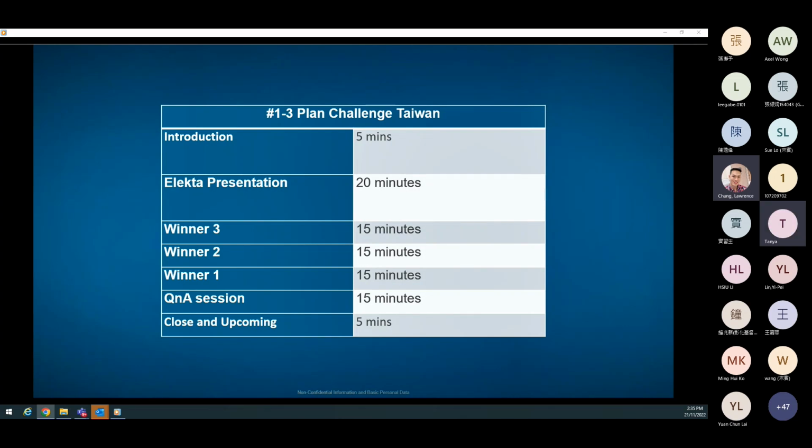And the idea is that users are going to be able to download these data sets onto your personal planning system. You're then going to be able to get instructions on how to try and get the maximum amount of points for each one of these cases, and then you'll be given about a month to refine your practice, to refine the plan that you've got, try and get the best score that you possibly can.